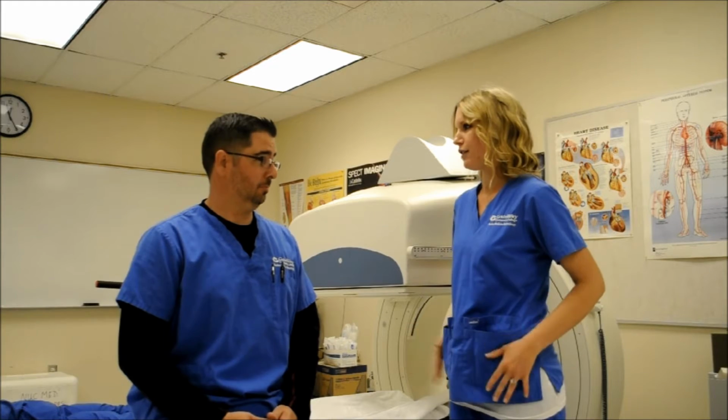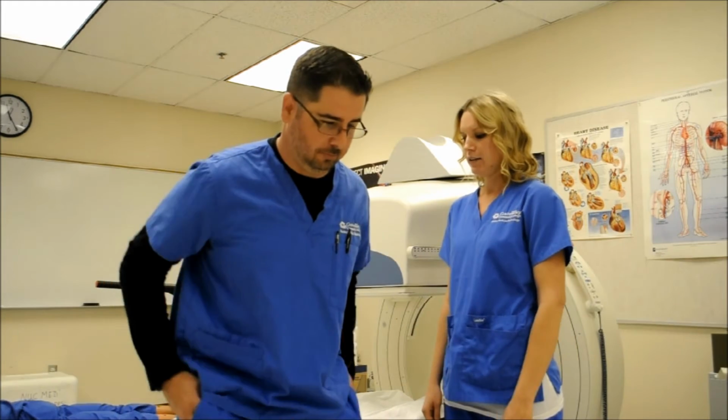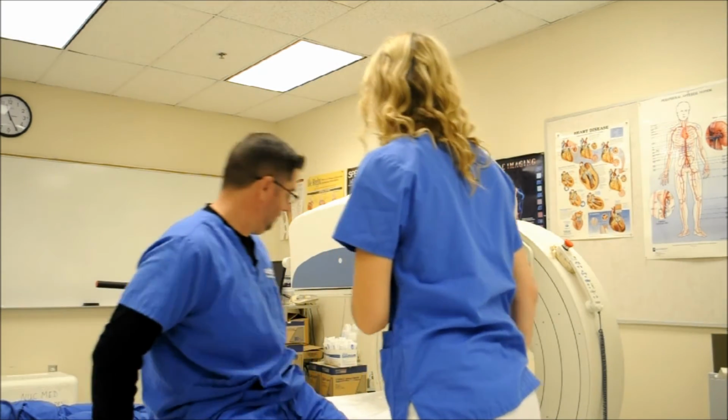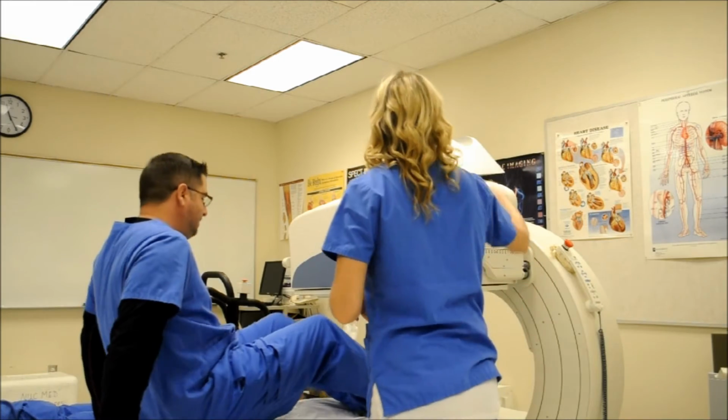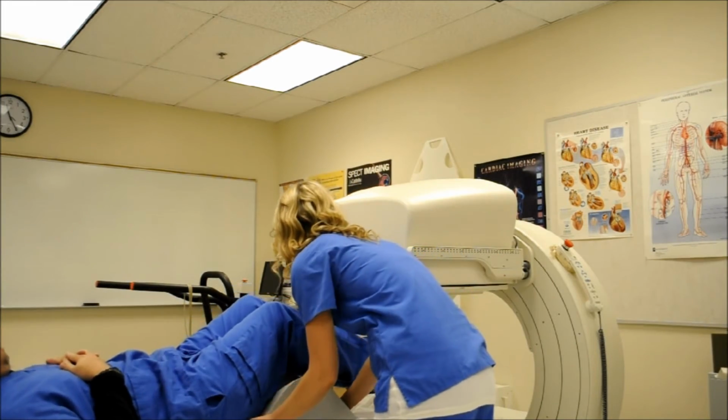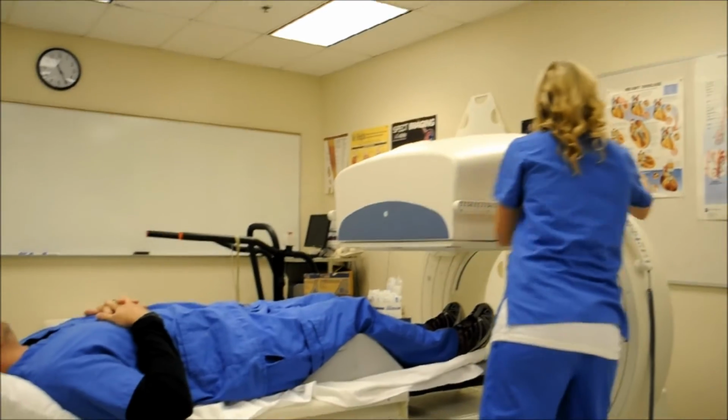So Rusty, what I'm going to have you do first is make sure you don't have anything metal in your pockets, because that metal can actually block the energy of that radio tracer. So go ahead and make yourself comfortable. I want you to lay your head on the pillows, feet down here on the ends. I have a pillow here to give you a bit more support.